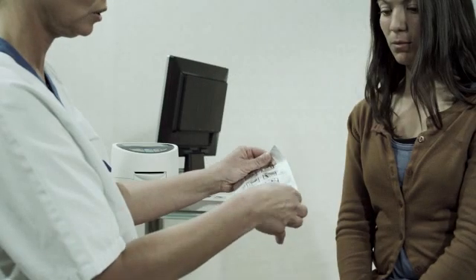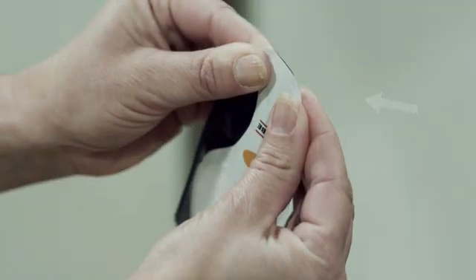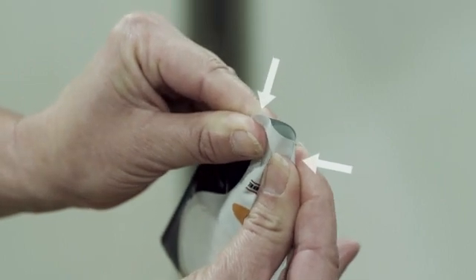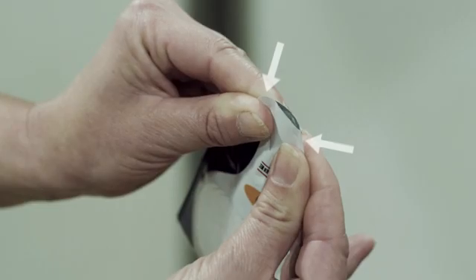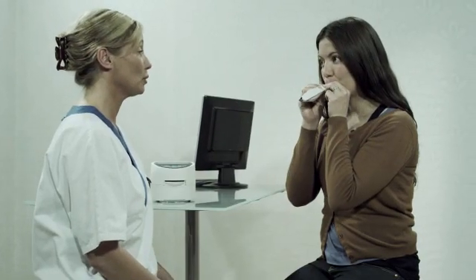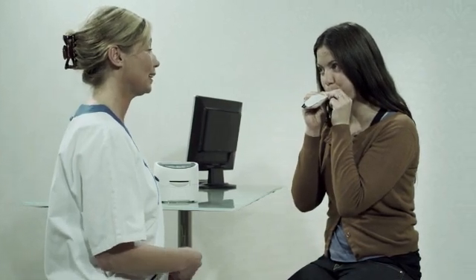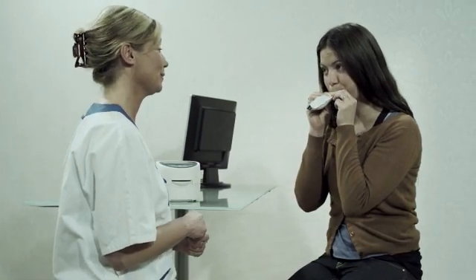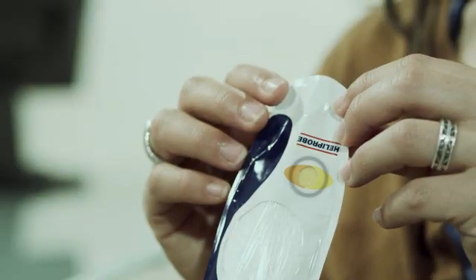Open the folio envelope and take out a breath card. Hold it between your thumb and index finger on each side of the opening and gently press the sides together to open the mouthpiece. Ask the patient to blow into the mouthpiece as if blowing a balloon up, and continue to blow into the breath card until the indicator changes color from orange to yellow.